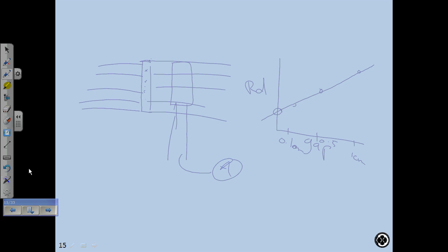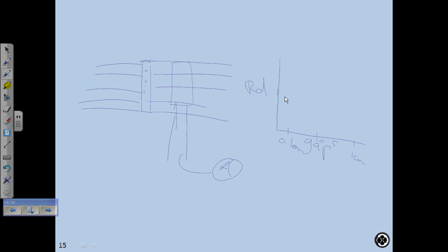The line doesn't go like that, it goes like this. So for a zero reading, your gap is somewhere down here. That's a very small number, whatever, 0.5 millimeters, etc. So that's a dynamic leaf RFO. This is how BrainLab does it. I'm just giving you three options on how to do it. The documents that I mentioned at the beginning, I believe one document explains one way of doing the RFO.